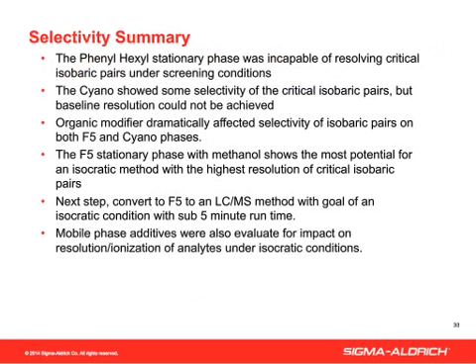So this is just a breakdown of the summary I just went over. From the screenings, we got some initial conditions that we felt would be able to resolve the epimer from the 25-hydroxy vitamin D metabolite. We wanted to further transfer those conditions to see if we could better optimize them to develop an isocratic method, and also look at other impacts that would improve sensitivity, particularly for the mass spectrometer. So now we're interested in getting the best ionization of the vitamin D metabolites out of our mass spec.